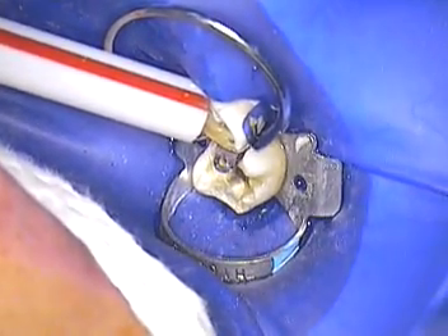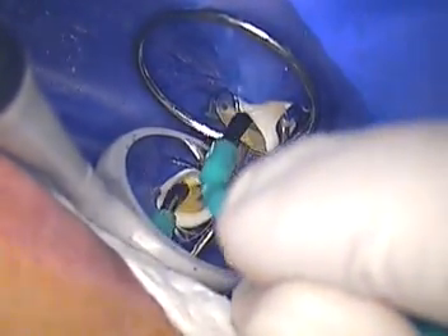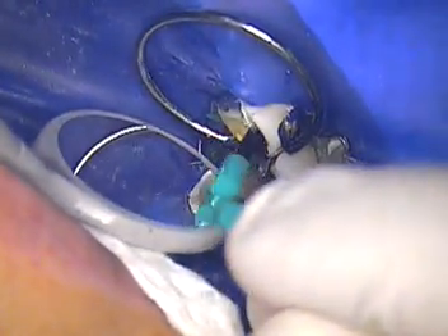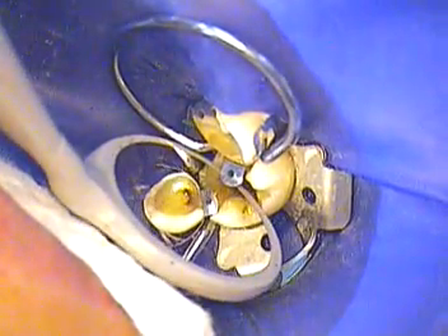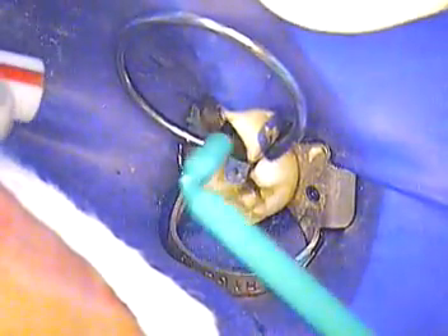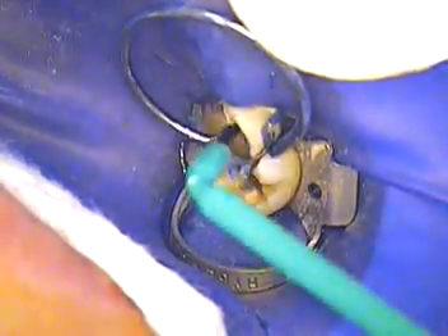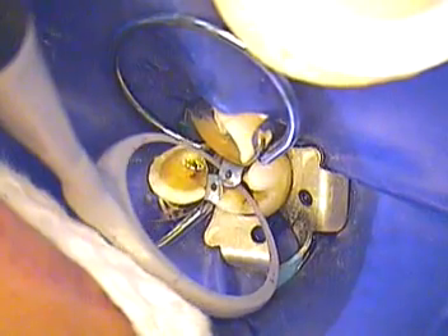We're getting rid of all those clogged dentinal tubules — we're going to chelate them open a little bit more, get rid of all that dentin mud and the smear layer. Now we're adding a primer from All Bond 3 — we're gonna give it a good three to four coats. Suction that really well. We're looking for a real super shiny surface. Looks great — we'll go one more time.